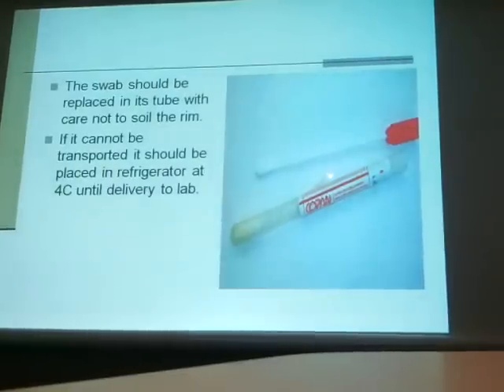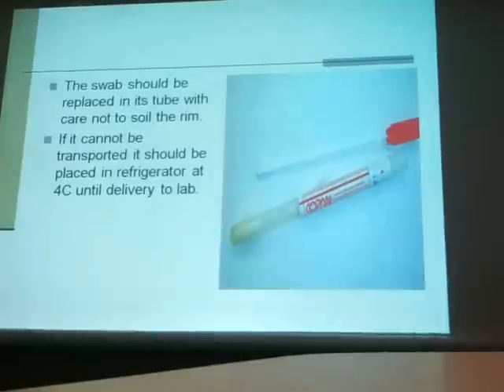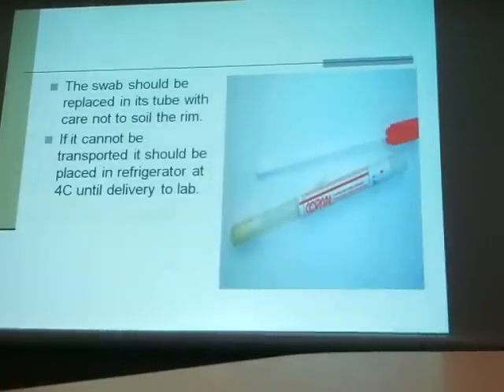If it cannot be transported as soon as possible, we must keep it refrigerated at 4 Celsius. We need to process it as soon as possible. If we have any delay, we must keep it refrigerated at 4 Celsius.